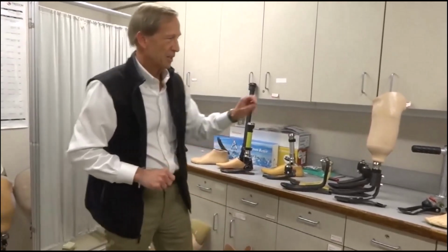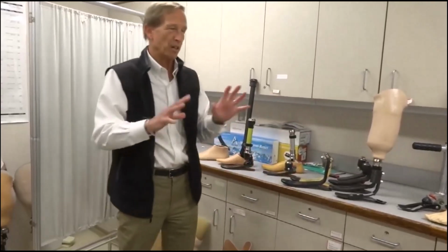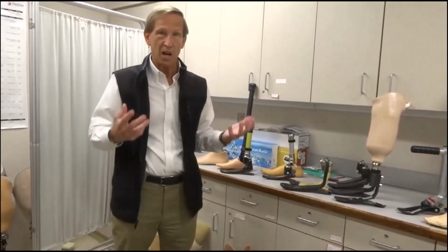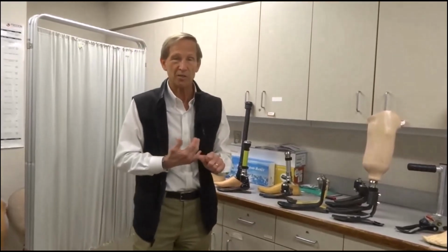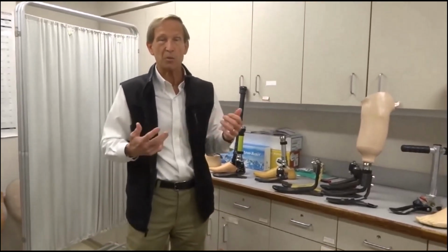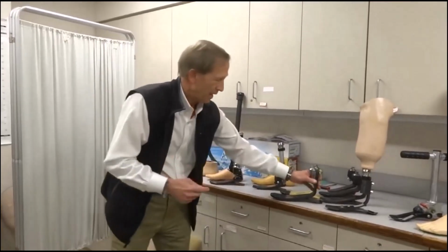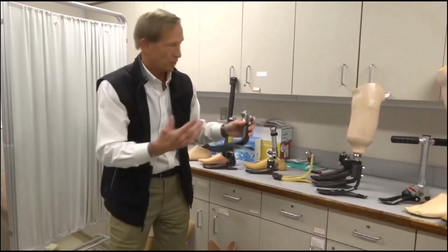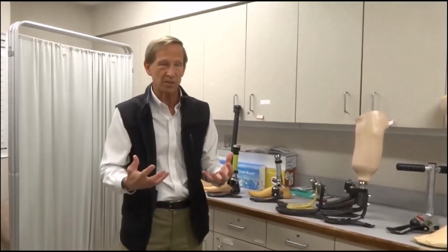Now, we have other categories of prosthetic feet too. So basically, the category 1, category 2, category 3 feet are what would cover most people. Now, there is a category 4. It is a very high performance type of category, typically for sports, recreational activities, and work. As you have seen, some of the people that run on TV have a sprinting type of foot that may have this long carbon strut, but no heel plate at all. So category 4 is for those high-level sports or activity-specific type of feet.